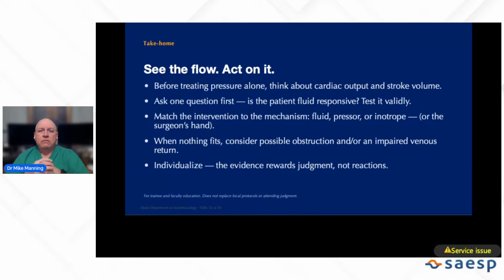So before treating pressure alone, I try to get people to think about the cardiac output and stroke volume. And the one question I want people to ask in the OR is: is the patient fluid responsive?